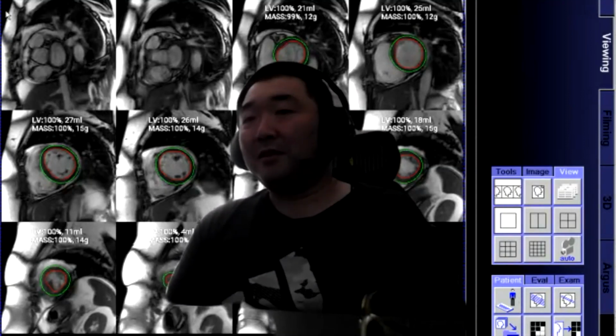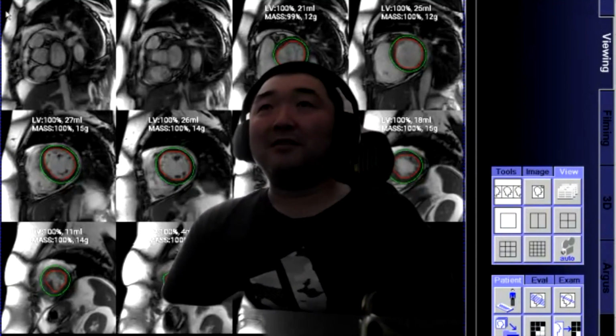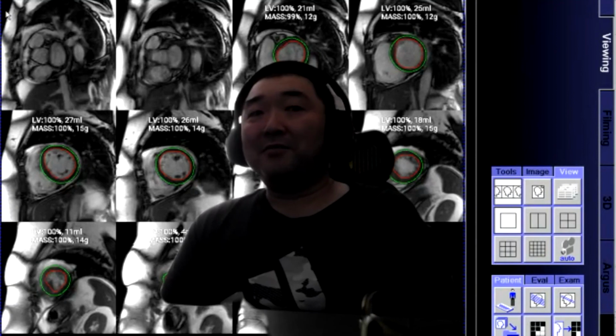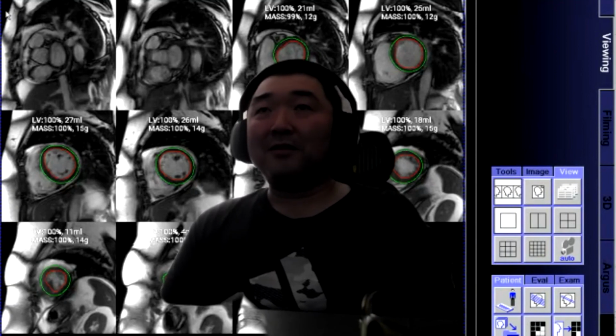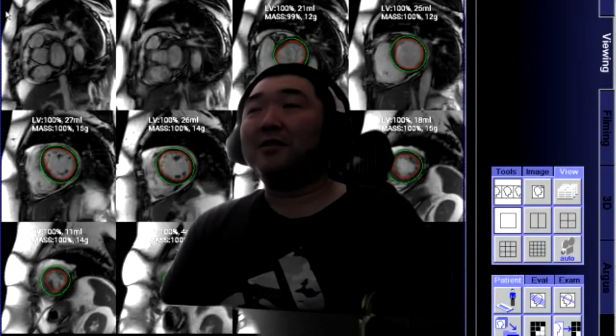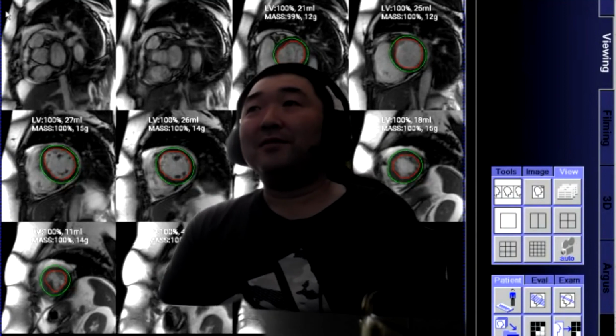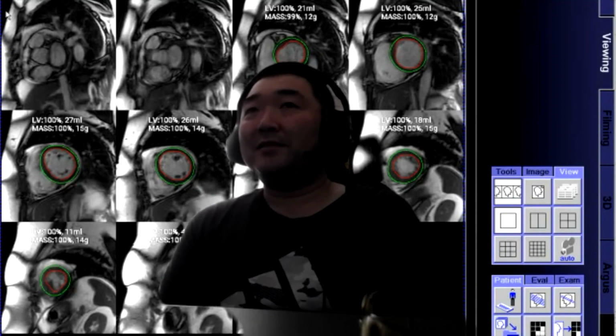Another use case is to run the Gadgetron as a chroot image on the scanner. So in that case, we can have the latest Docker that make the chroot, then send the sites this installation package, then they can update themselves. Okay, thanks.